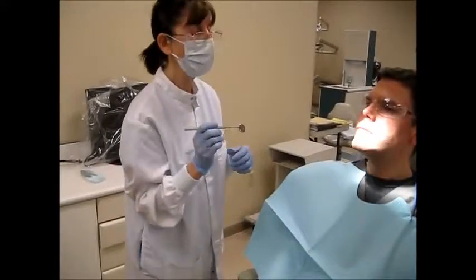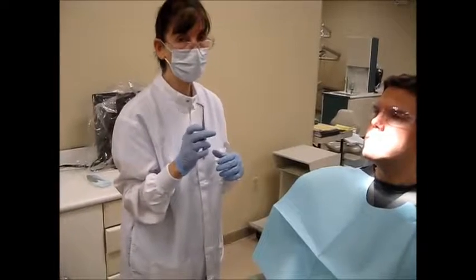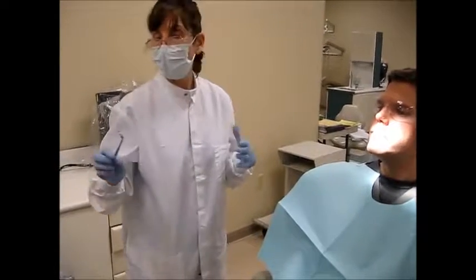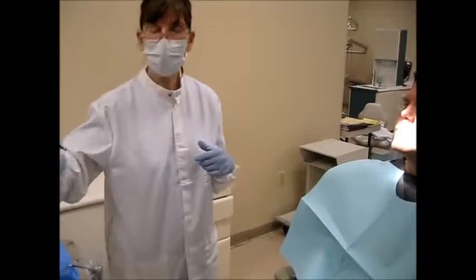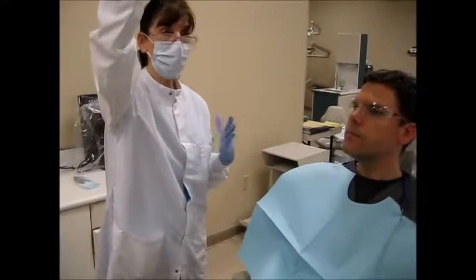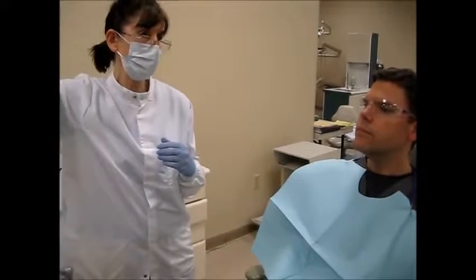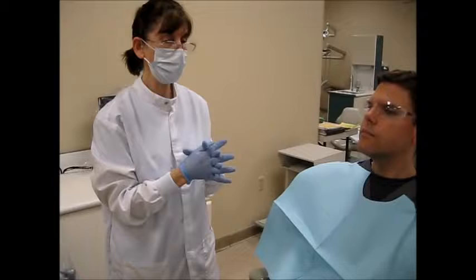Once again, not hitting the hard tissue of the teeth with the mirror at all to disrupt that bond. And finally, reminding the patient once again that they're not going to be able to eat, drink, smoke, chew gum, anything that could disrupt that bond for 30 minutes, and providing them with the actual time frame.